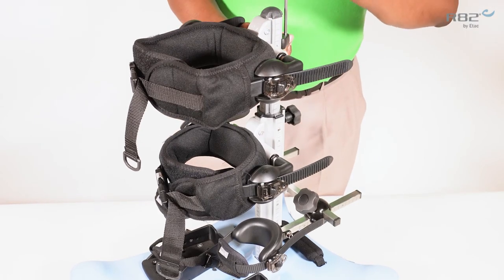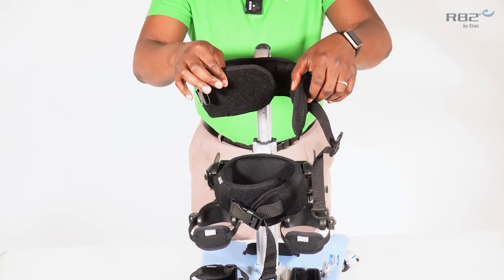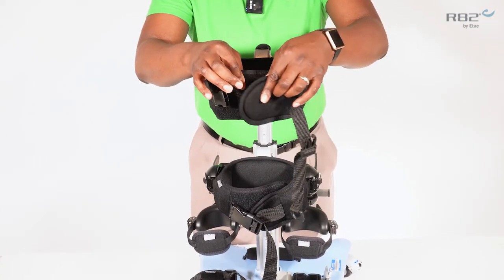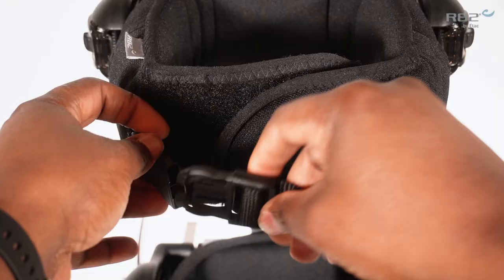Securing the trunk and hip support on the Meerkat is performed with first using the velcro closure, followed by the buckle.